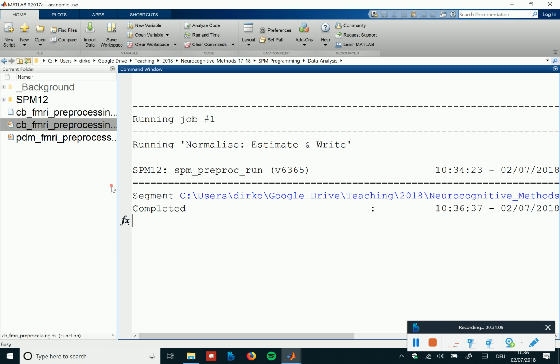There's also an increasing number of pre-processing standard routines from all these people. Would you recommend using that? I mean, not the Pi thing, but in SPM. Yeah, I mean, whatever.